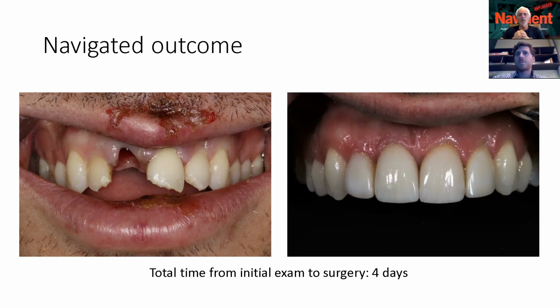That's great. So the take-home message that I think is most dramatic is always maintaining the anterior tissue, avoiding any loss of bundle bone, and always use dynamic navigation. Is that how it works?